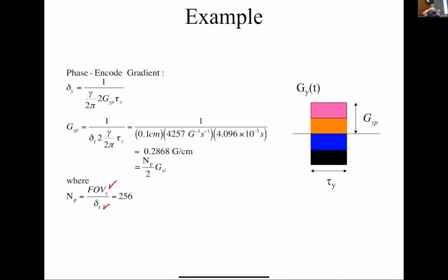So I probably need about 256 samples along KY to have the same amount of information. This is just saying that this amplitude divided by these deltas gives me half those samples. So if I had 256, I'll have about 128 here and 128 below.